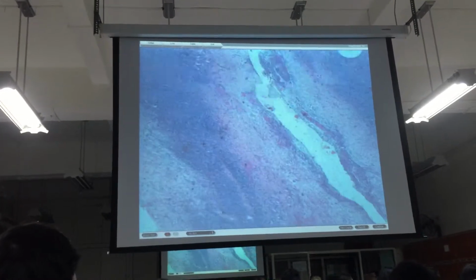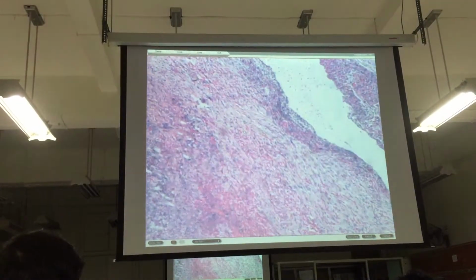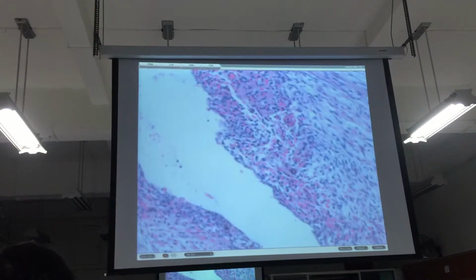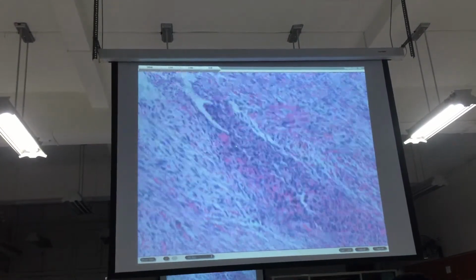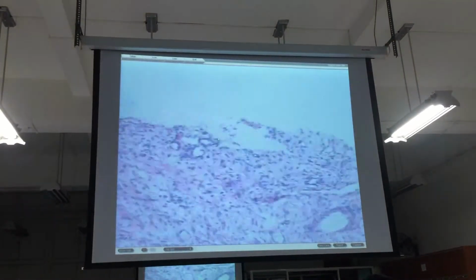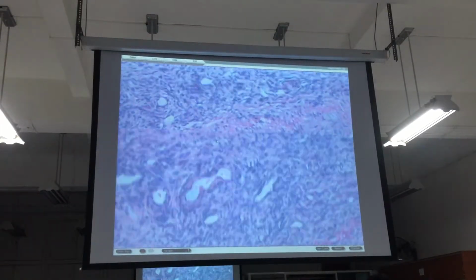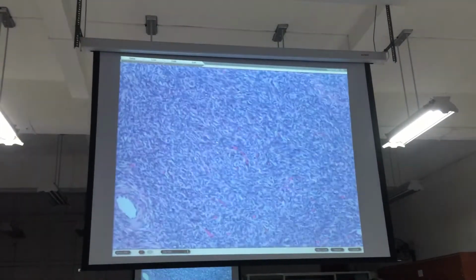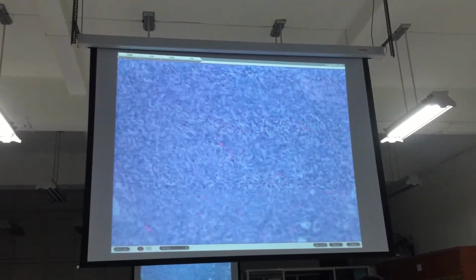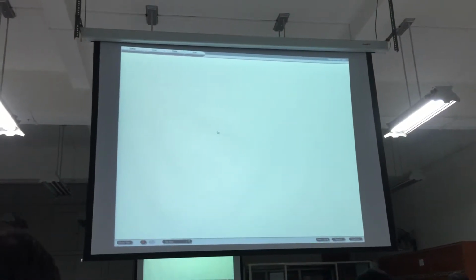So, again, this is your cyst lined by stroma. This is endometrial stroma. Okay. Hemosiderophages are sometimes seen in the lining because of the constant hemorrhage that is happening in the lining of the cyst. Okay, that's your endometrial cyst. Next slide, 06.